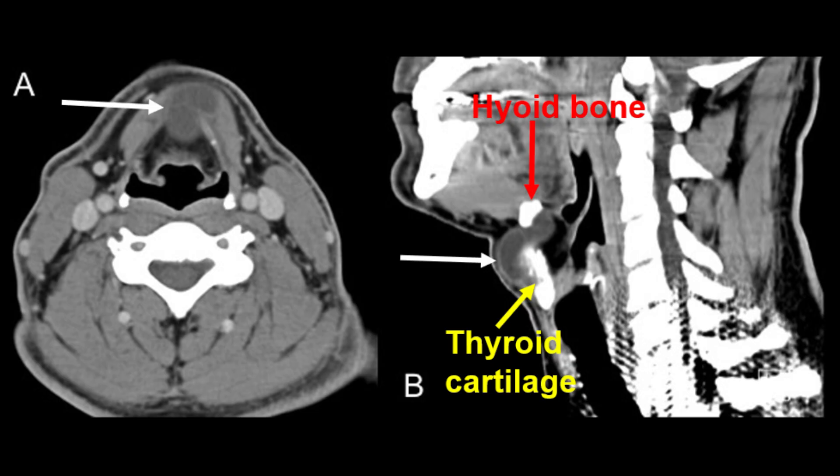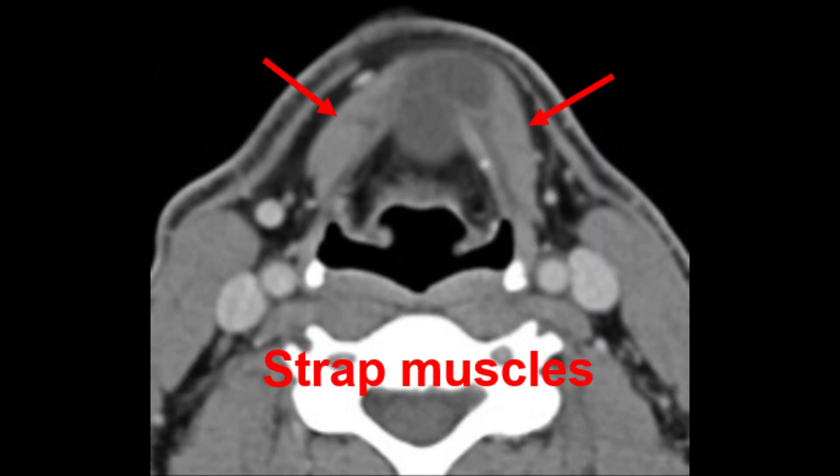To be more specific, it lies between the hyoid and the thyroid cartilage. Returning to the axial images, the lesion is in the midline embedded within the anterior soft tissues of the neck. It also appears to be nestled between the infrahyoid muscles, also known as the strap muscles. This detail is important for identifying its anatomical track.